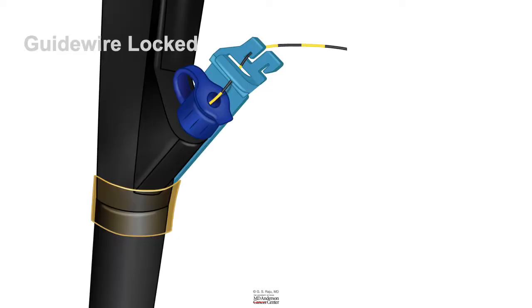So here we have already done a sphincterotomy, and this is a case of CBD stones that need to be removed. We have used a rapid exchange sphincterotome.